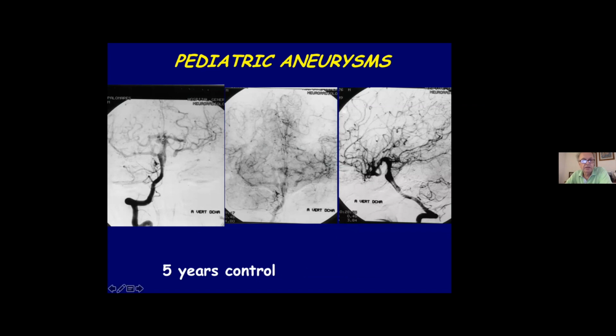You see the collateral anastomosis with the posterior communicating artery, still open and now open. And this is the evolution. This patient had a vascular dysplasia, elastorhexis. I think it's Ehlers-Danlos. And 20 years after this control, the patient came to my consultation with bleeding and death.